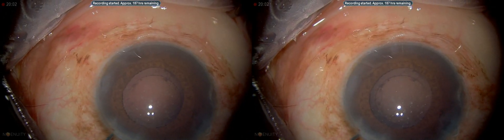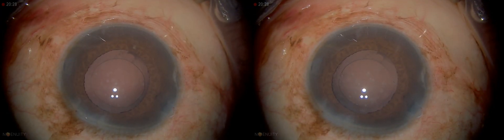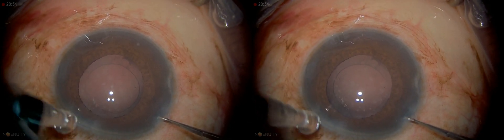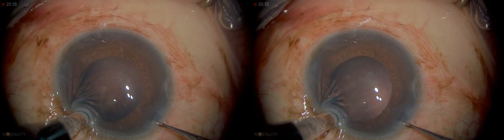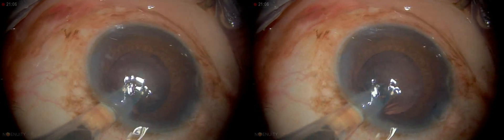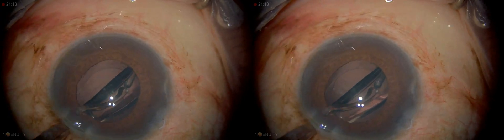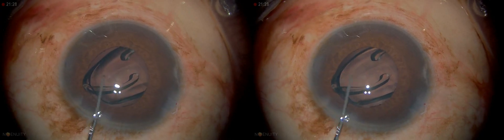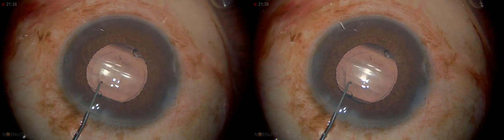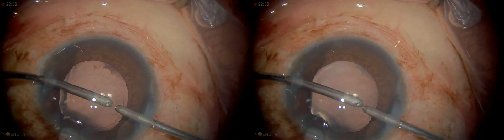We'll go ahead and put viscoelastic into the anterior chamber. I usually try to get under the bag before I inflate it. The asteroid makes it very hard to appreciate the posterior capsule — it's already hard enough to see, but now it's very hard to see. I want to hold the injector vertically — see how vertical it is? Then you can just push straight down and twist it in. As soon as it's in, you can flatten it out a little bit and then inject the lens. We want to rotate this in — I like the haptics a little horizontal, which prevents or reduces negative dysphotopsias for the patient. We want to go in our little paracentesis and remove that viscoelastic.